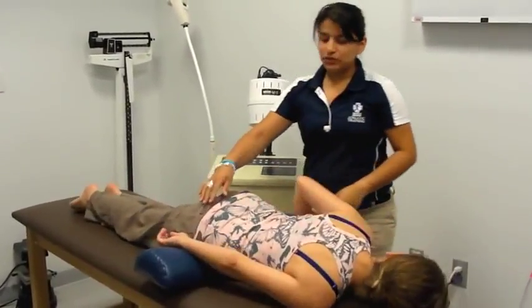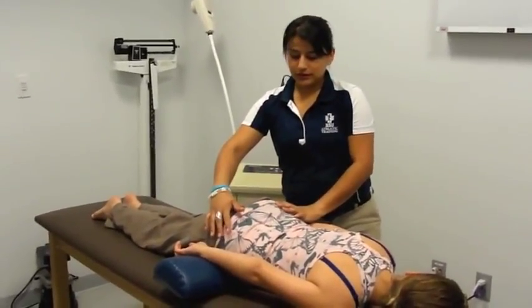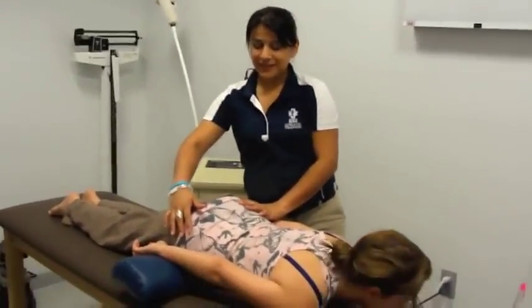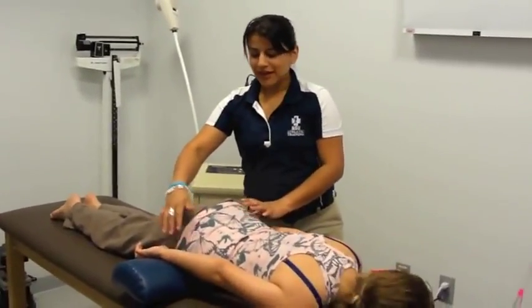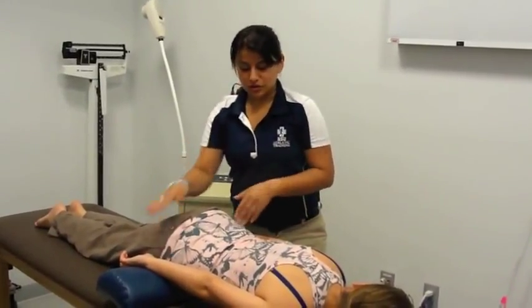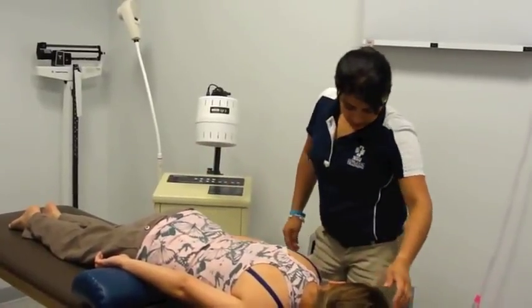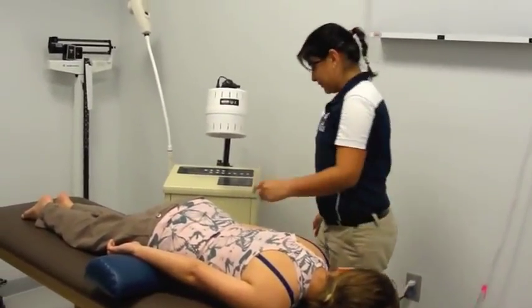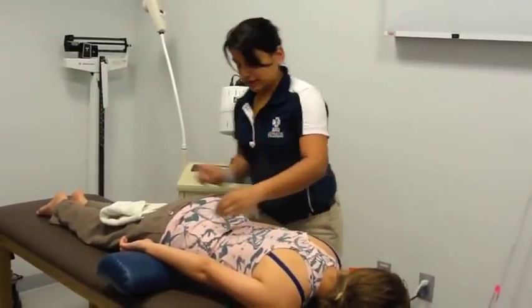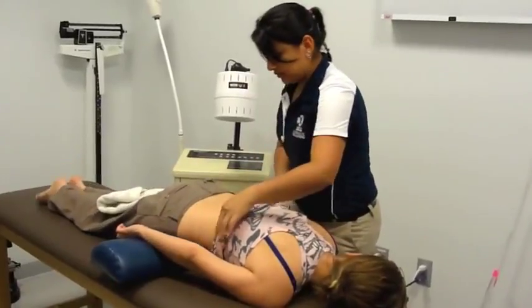The patient needs to be comfortable, and the pillow needs to be placed under the hips so the spine can be in a neutral position. Are you comfortable in that position? Yes. Okay.